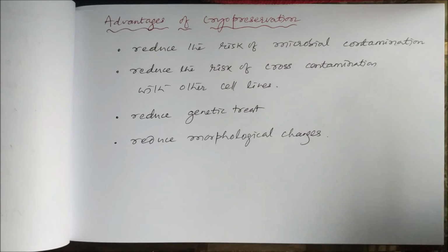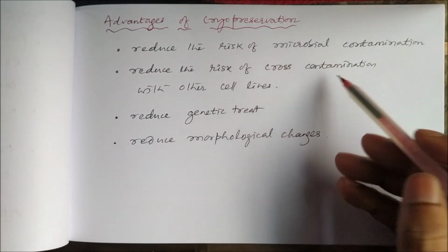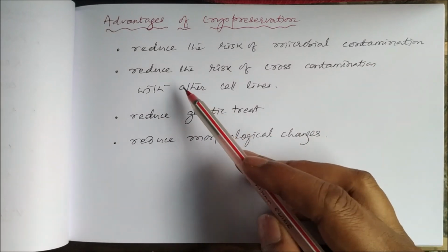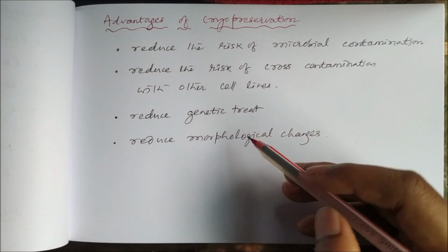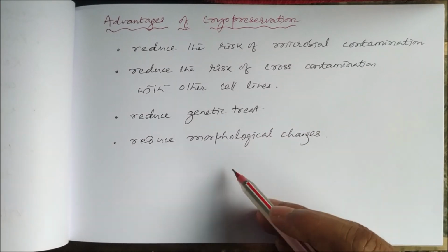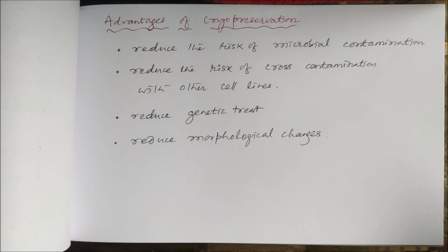What are the advantages of cryopreservation? Cryopreservation reduces the risk of microbial contamination. It reduces the risk of cross contamination with other cell lines. It reduces genetic drift, and it also reduces morphological changes. So this is all about cryopreservation.